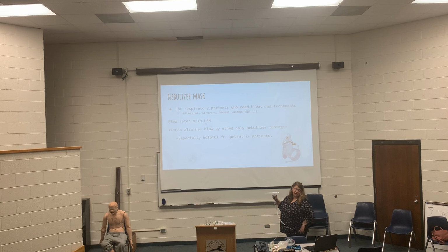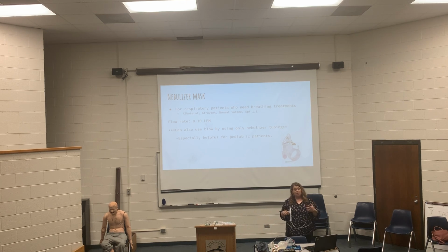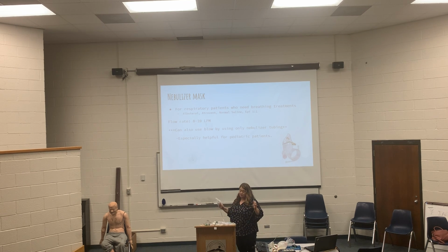So the flow rate for this is 8 to 10. I always keep it at 8. That's just cause I know it is effective then. If you do it any less, they won't be getting the medicine as well. If you do it any more, it's like forcing air, and they'll get a very bad dry mouth.